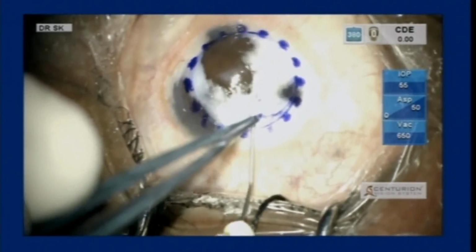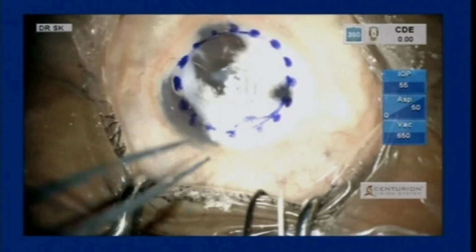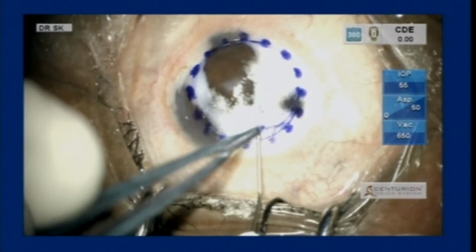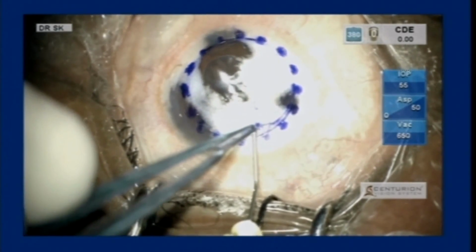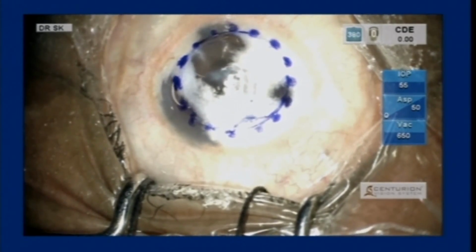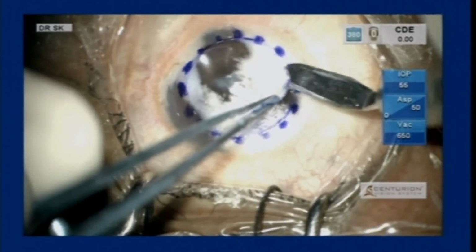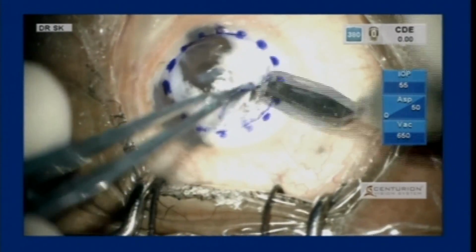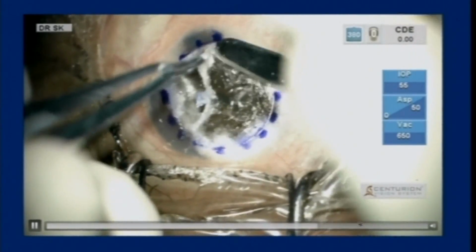In this particular case, we got a big bubble on the third attempt, but a perforation happened at the end of the big bubble formation. There is a type 2 bubble formation, and there is a perforation. Two air bubbles entered into the anterior chamber, and I went ahead with the manual layer by layer dissection. With centripetal dissection, I could complete deep anterior lamellar keratoplasty in this particular case.